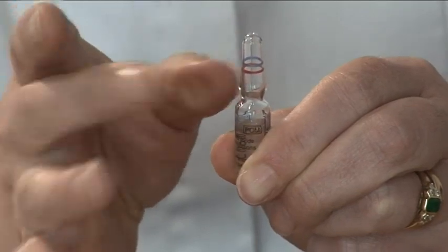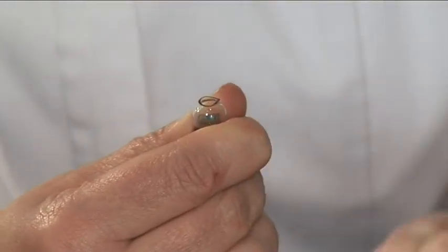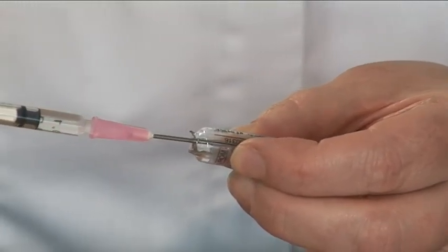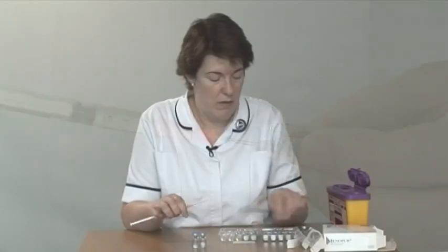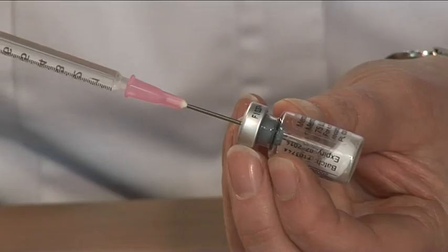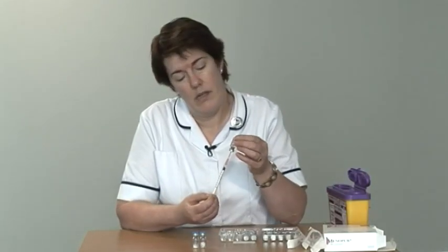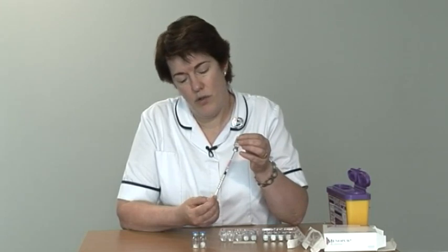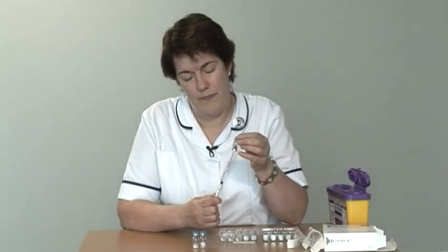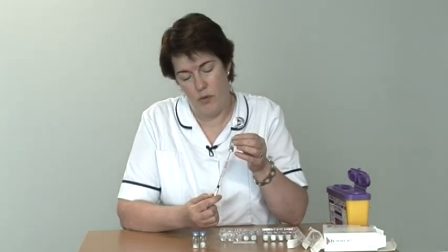Take the top off the diluent, suck it all up into the syringe, squirt it into the first powder, dilute it, draw it all back up into your syringe. Again, being careful to make sure that you've got all the liquid.